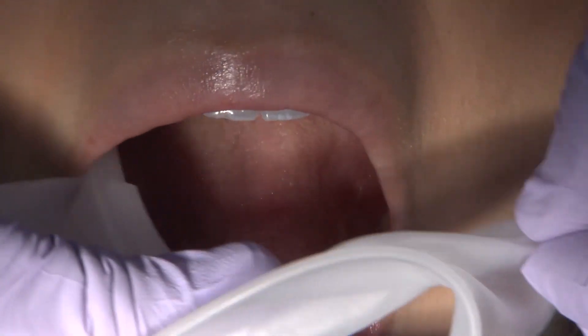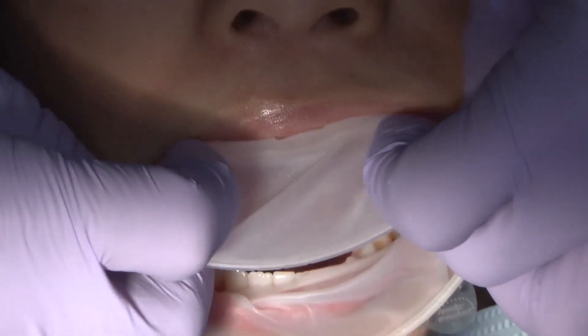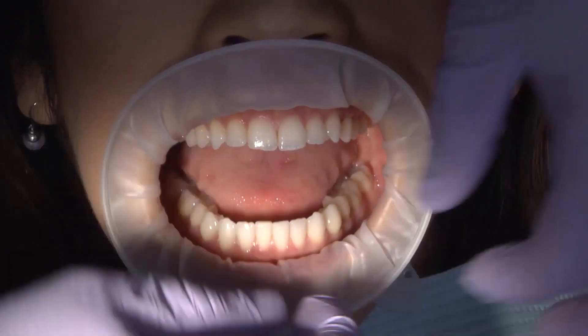Any leftover Vaseline can also be applied directly to the lips. Place the retractor in the mouth side to side and then fold the lower and upper lips into position for a comfortable fit.